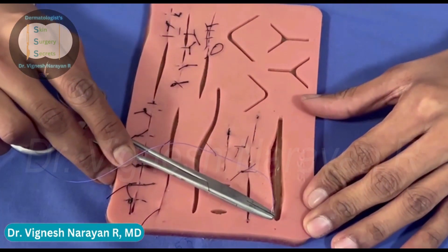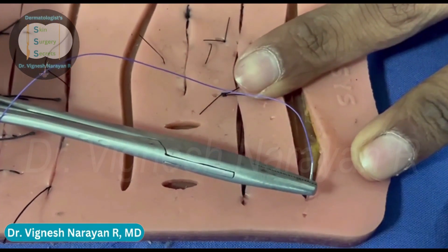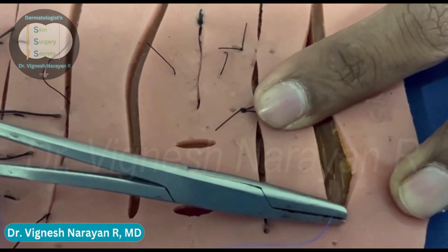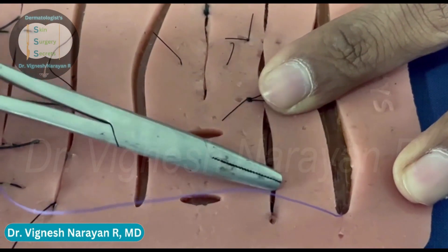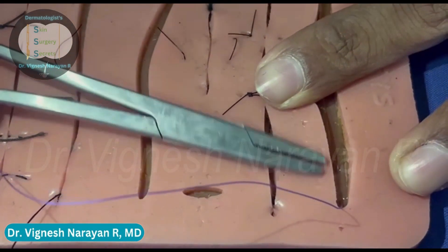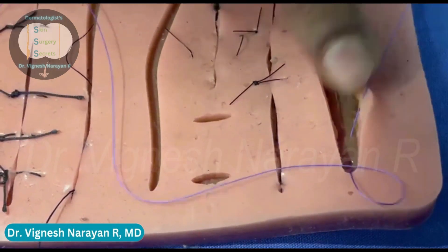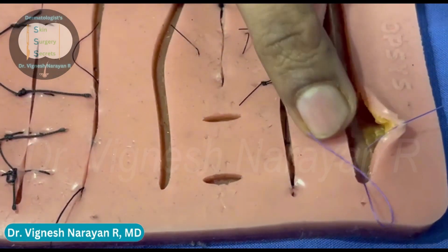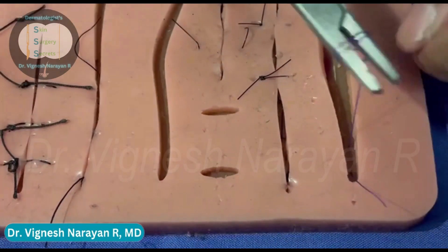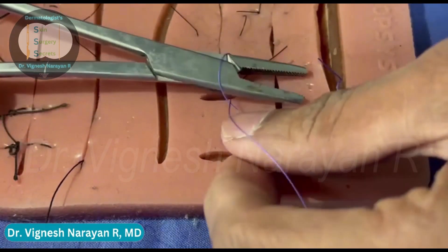The next step is to anchor your suture material. Here I'm passing my needle entirely in the subcutaneous tissue. You need to hold the needle such that it faces towards you, and you're going to enter and exit both in the subcutaneous tissue. This is going to anchor your suture material to the subcutaneous plane. Here you can see the needle has entered and exited both in the subcutaneous plane. I'm going to secure this suture material with a surgeon's knot — two throws and then one throw in the opposite direction.